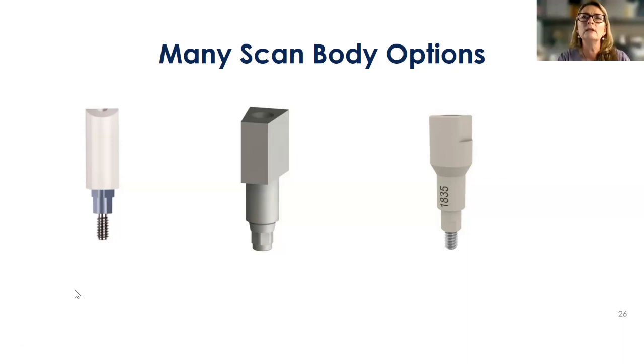I've got a question real quick. Could you run through when we would use the pre-treatment scan? Yes. And the difference between the first and second scan? Absolutely. Was doing a scan for a crown prep and deleted the partial segment after processing. Okay, yes, I will address that live. And if you have a further question to that, please let me know.